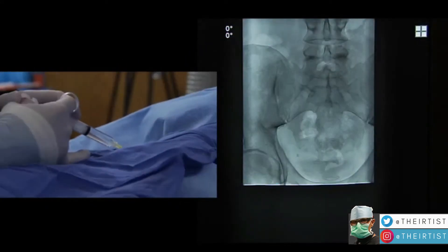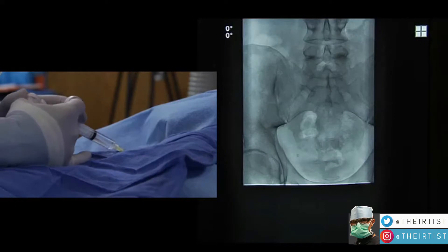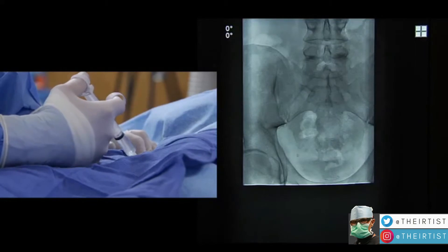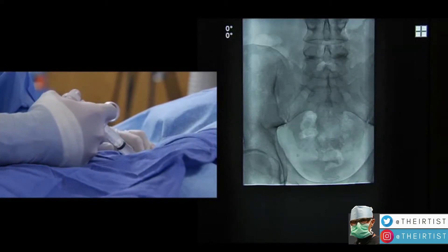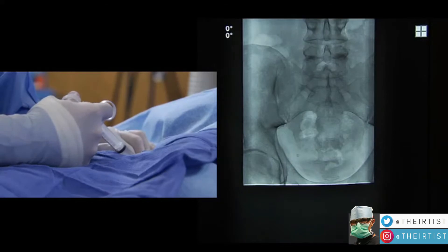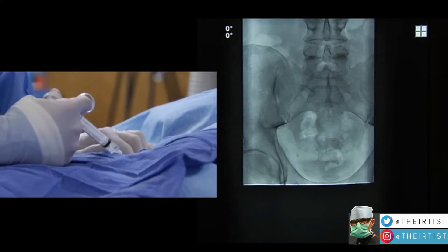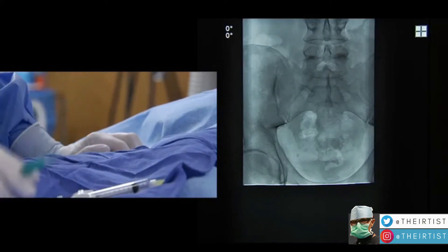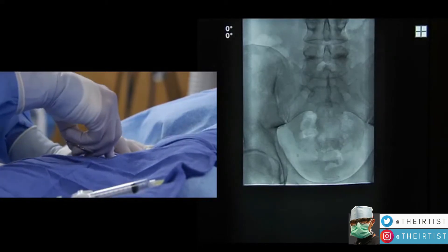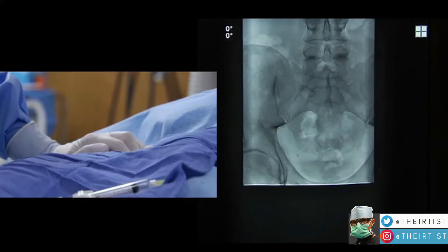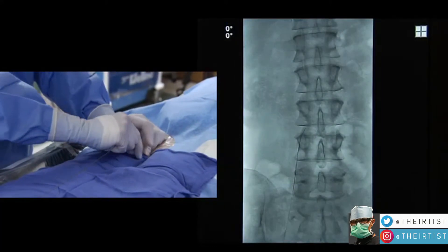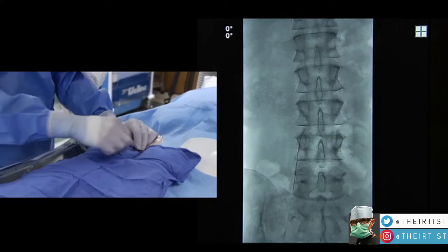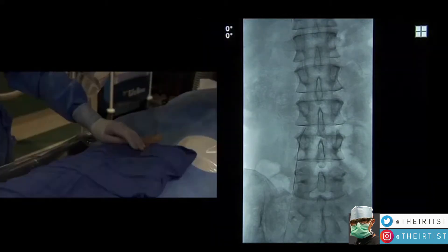Now we're going to see a real case of varicocele embolization performed by an interventional radiologist. The procedure starts with infiltration of local anesthesia — one of the main advantages of this procedure is that it can be done under local anesthetic only. There is no need for general anesthesia, no tube in the patient's throat, and none of the cerebral risks that may happen during general anesthesia. Recovery is also much faster.